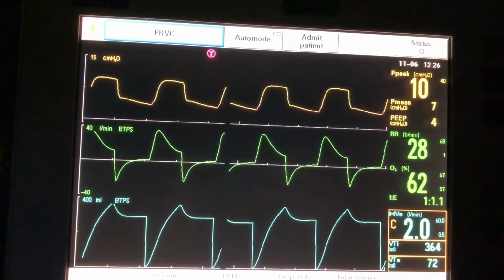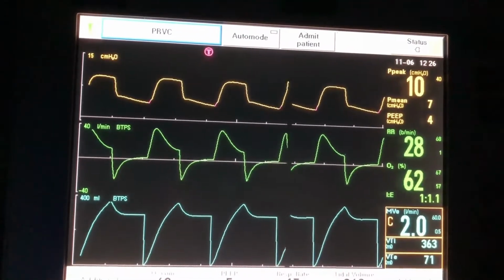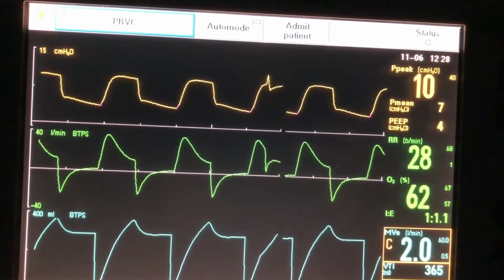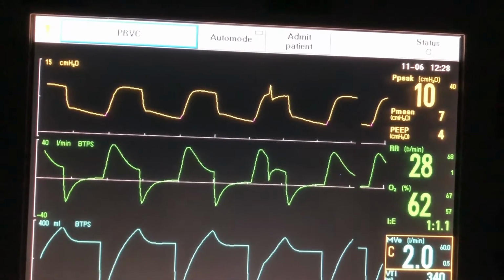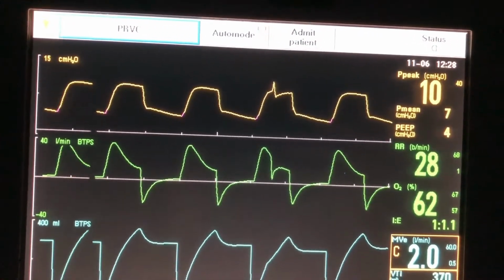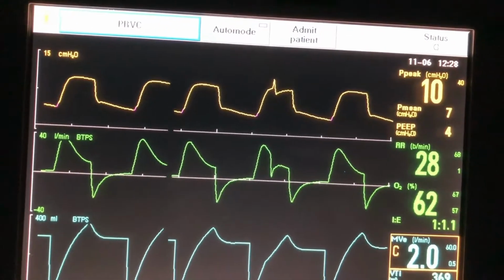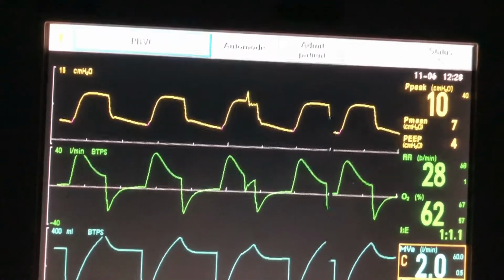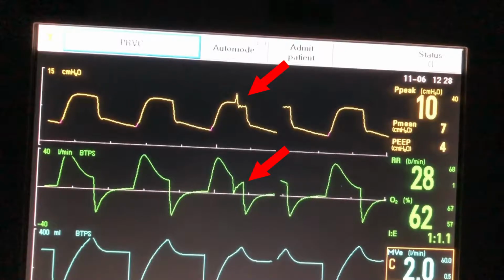The following represents pressure and flow tracings comparing the accuracy of the Go Pilot to a manual actuation by respiratory therapist. The therapist is asked to initiate the metered dose inhaler at the initiation of the respiratory cycle when gas flow is at the greatest.